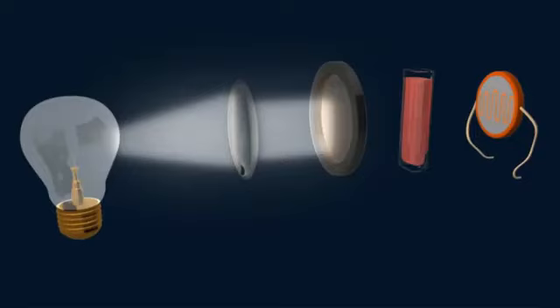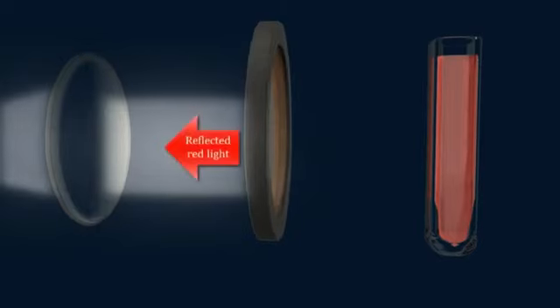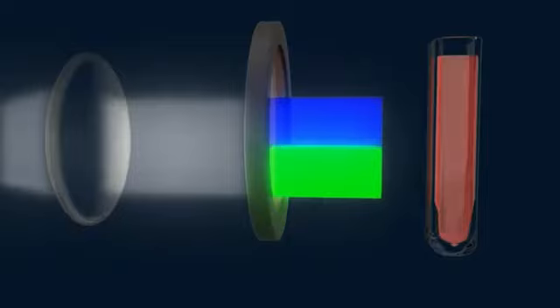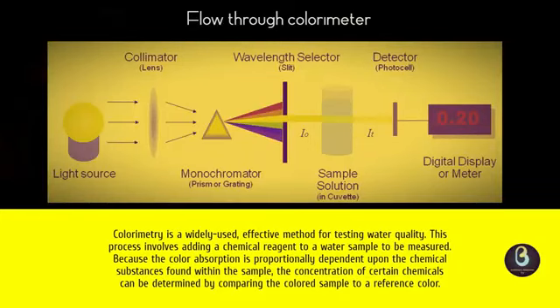The next component is the flow-through colorimeter. The colorimeter is to measure the intensity of color produced in the reaction and to provide a graphical display of change in color with time. The use of a double-beam spectrophotometer is costly and is rarely justified by analytical requirements. The single-beam colorimeters have insufficient stability to operate reliably over a long period required. The AutoAnalyzer MKI colorimeter combines double-beam operation with interference filters to select the wavelength.